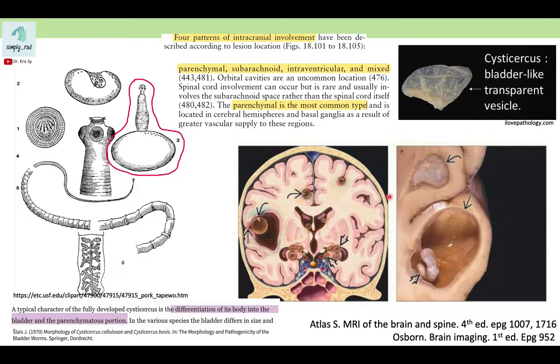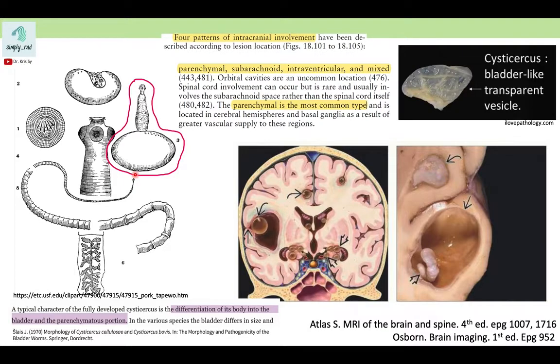On imaging, we see a cystic structure with a dot in the periphery — that dot is the scolex. This cystic structure is actually part of the worm itself; it is the form of the worm in its life cycle called a bladder worm. It has this cystic focus creating this cystic structure on our imaging.